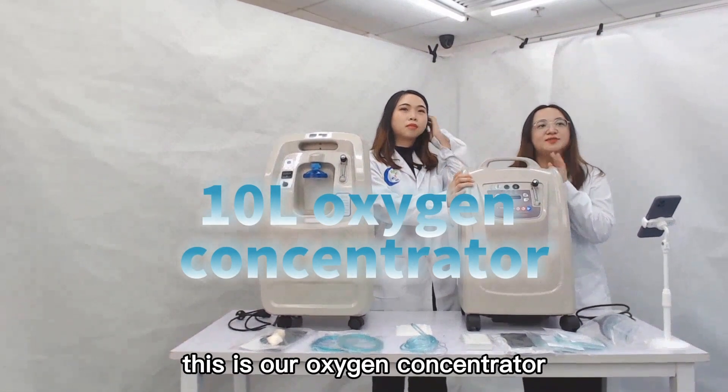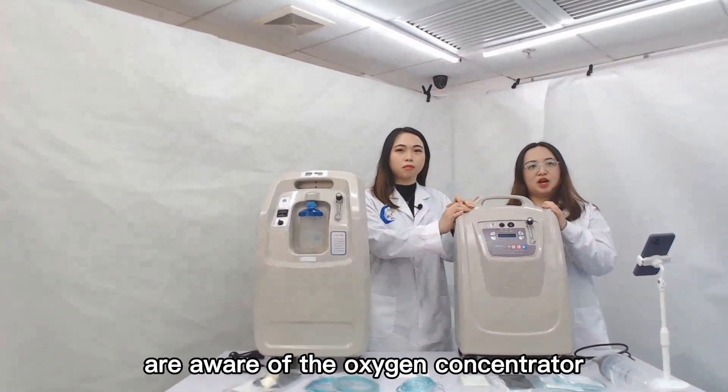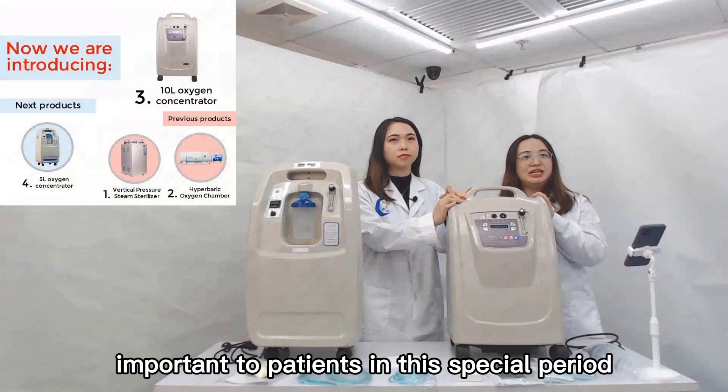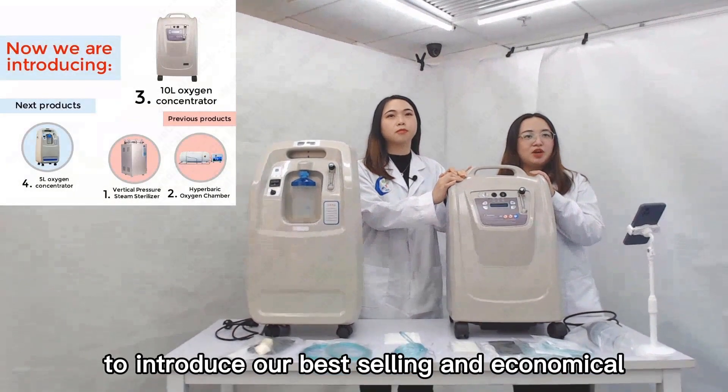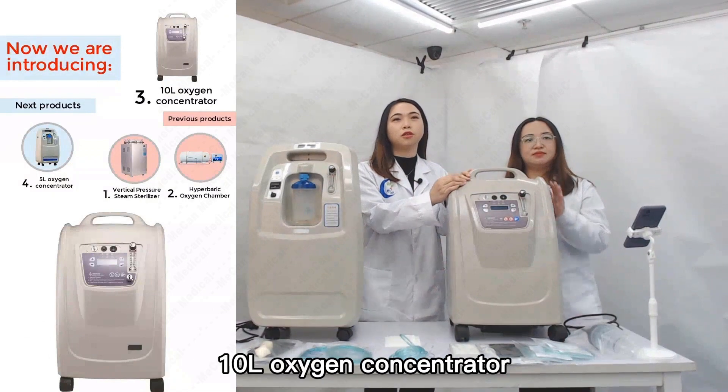This is our oxygen concentrator. In this pandemic, many people are aware of the oxygen concentrator, which is very important to patients in this special period. Today we are going to introduce our best-selling and economical oxygen concentrator. Now let's start to introduce this 10-liter oxygen concentrator.